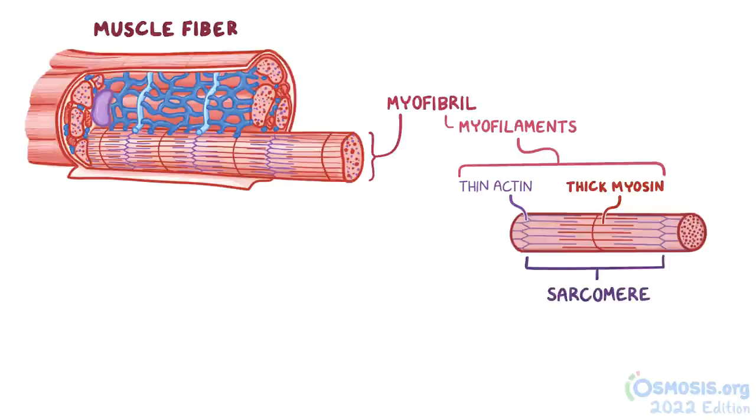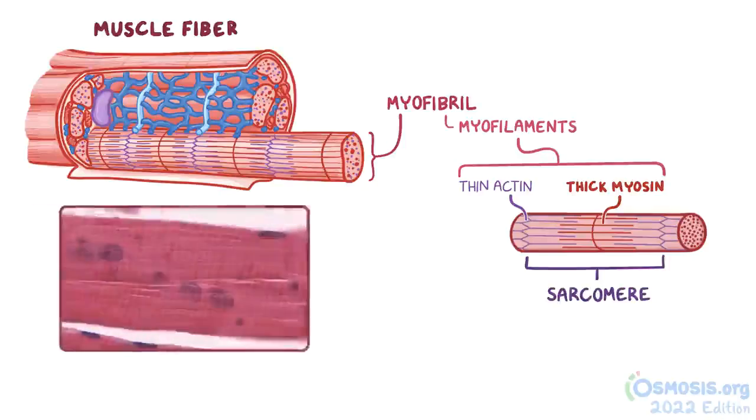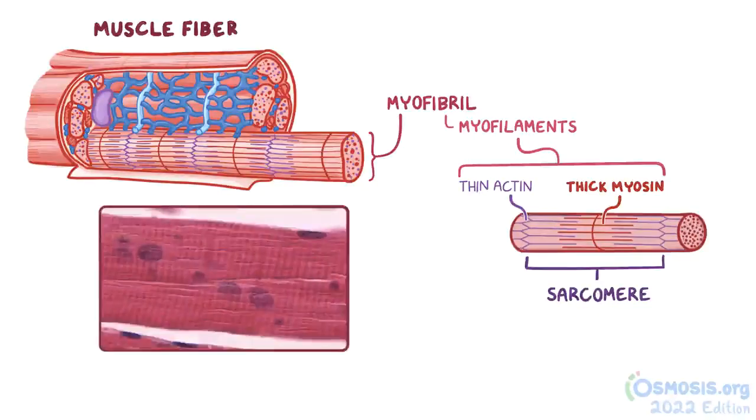The alignment and structure of the sarcomeres result in perpendicular bands that can be seen in this image as striations that run vertically. These striations can be seen in both skeletal and cardiac muscles.